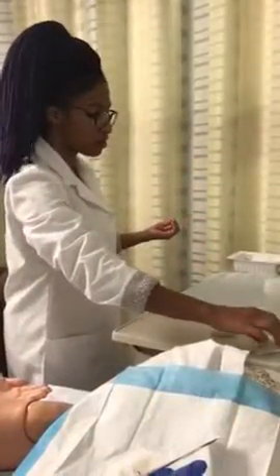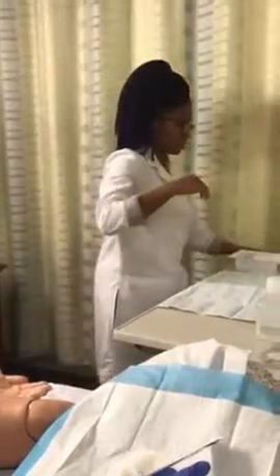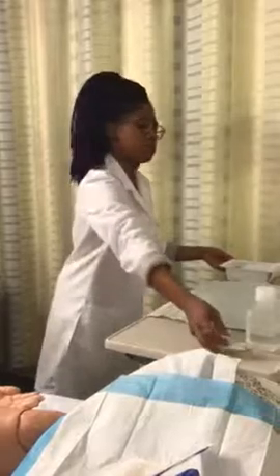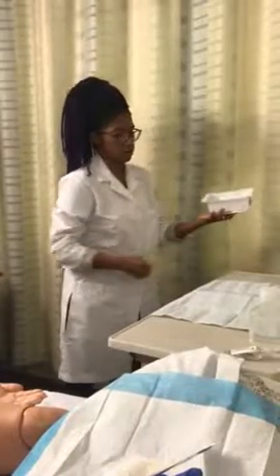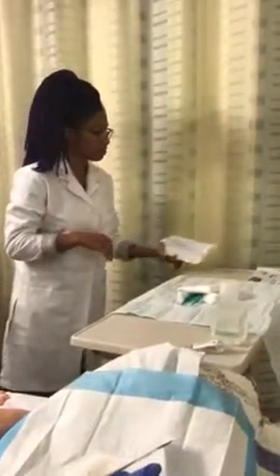And what is hanging over the edge is now no longer sterile. I made that a note to myself. And now I'm ready to dump all of my supplies onto my sterile field, making sure to maintain my 1-inch border.